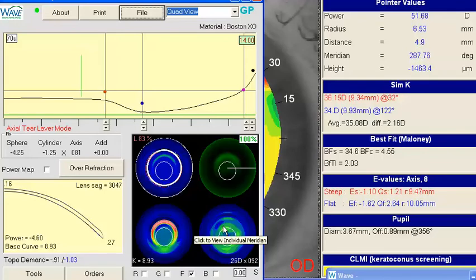So with this design, you end up with a very precise fitting lens using freeform on a very averaged out cornea. So I think you'll miss some corneal data. So in essence, it may be possible that your difficulty lies with a cylinder refraction. Wave may be interpreting this as a spherical cornea and creating more of a front toric lens for this cornea, thus creating some distorted vision and maybe a rotated cylindrical effect. So that would be my best observation.